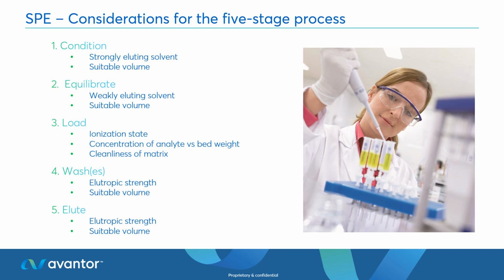In terms of the load stage, the ionization state becomes important, so we need to make sure that we've modified the pH accordingly. We also need to be aware of the bed weight and make sure that we can choose a suitable bed weight for the type of sample that we'll be applying and for the concentration of the analyte that we're looking for. We also need to be aware of the cleanliness of the matrix as well, because that will potentially take up some valuable surface sites on the surface of the stationary phase for the solid phase extraction sorbent.